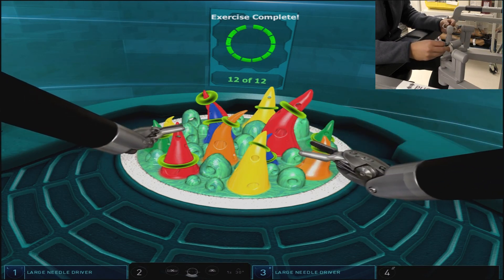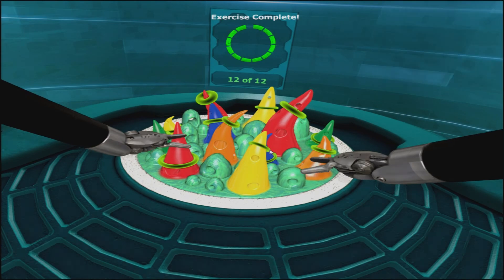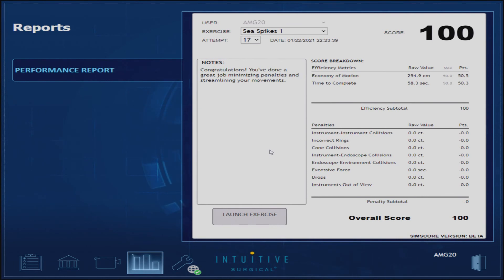The scoring system for these exercises is based on several factors. Your timing and economy of motion provide a base score of 100, and any penalties are subtracted from this base score. You can see that we were efficient with a base score of 100 and didn't commit any penalties to take away from that base score.